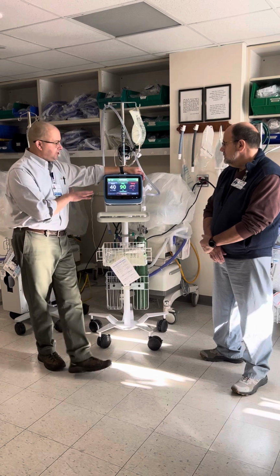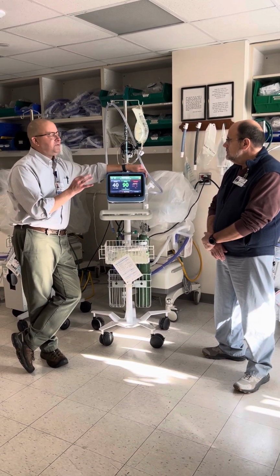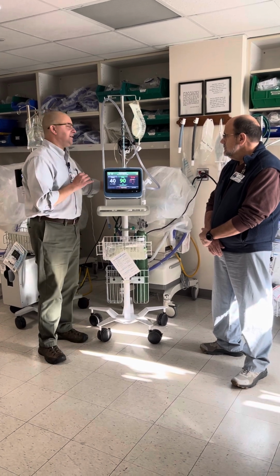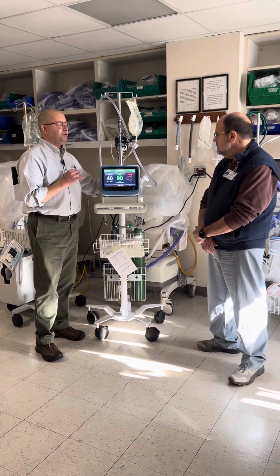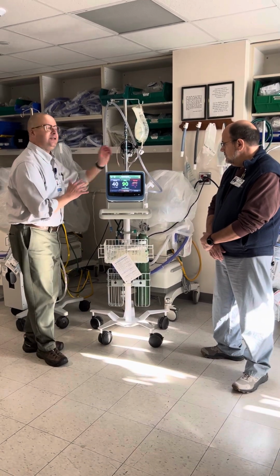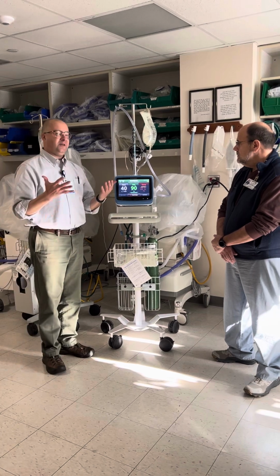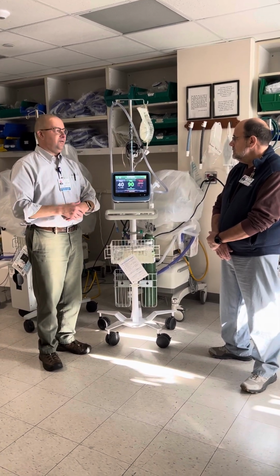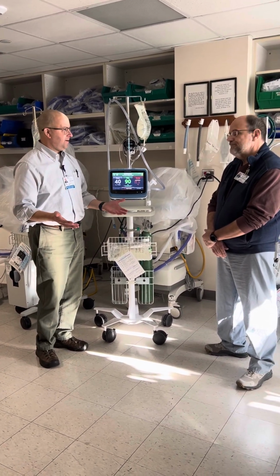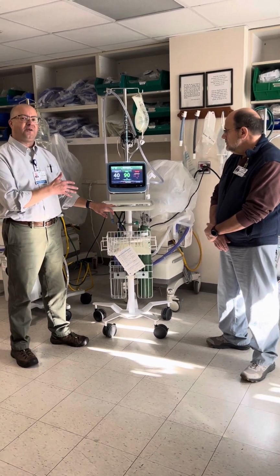The nice thing about this unit is we don't need medical air. When they designed the HVT 2.0, they built in an automated unit that pulls in room air, which allows us to adjust the oxygen without needing medical air or a compressor. So what's the benefit of this on 3 North? Like we talked about, there's no medical air up there. The nice part is that our patients don't have to listen to that noisy compressor running.